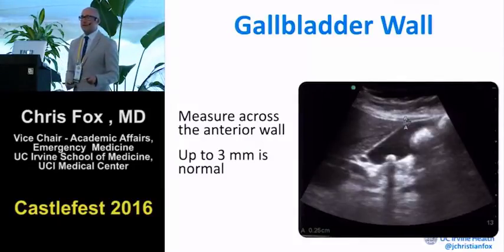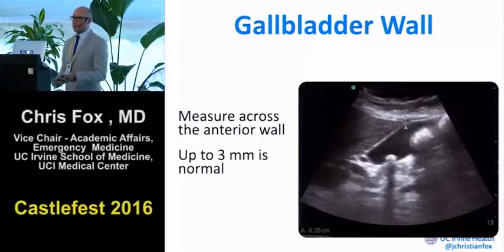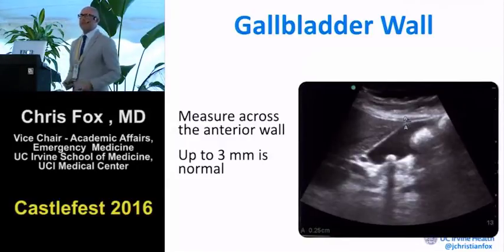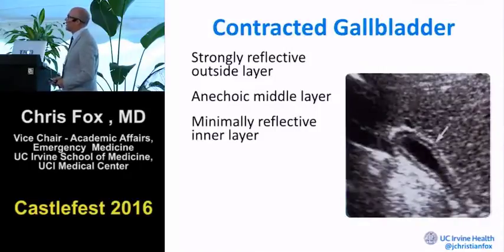And depending on their insurance, between 3 and 5 millimeters would be normal or abnormal. So I have my surgeons come down: 3.5 millimeters. Yeah, we're going to take it. We think it's acute cholecystitis. We'll take them. Oh, look at that, PPO. Oh, another patient comes in self-pay. Well, it's not 5 millimeters yet, so I think we can sit on this one a little with some antibiotics. We see that a lot.